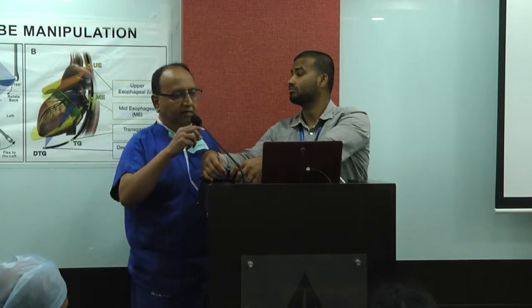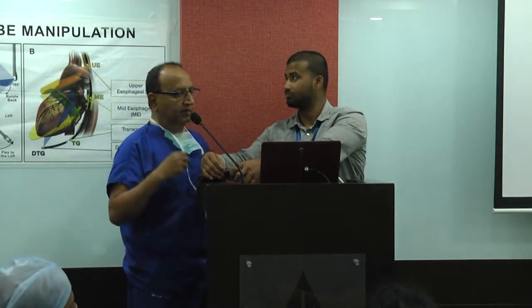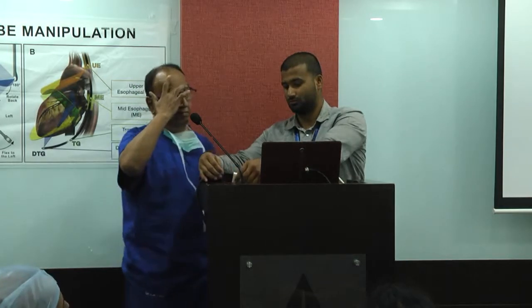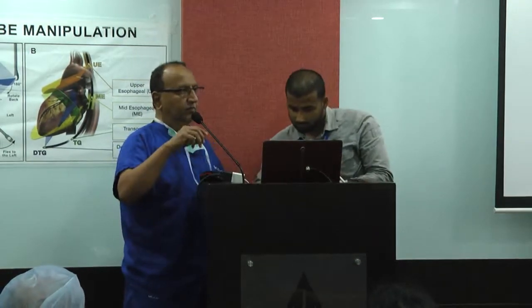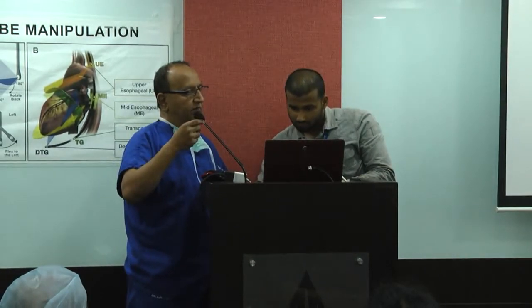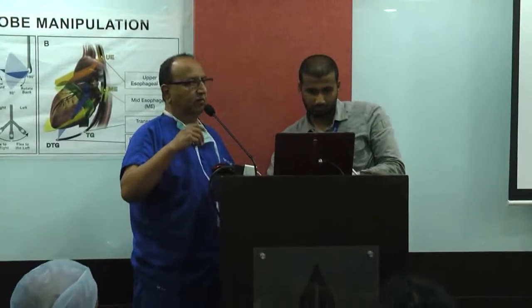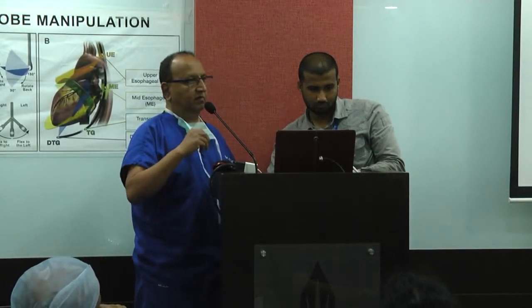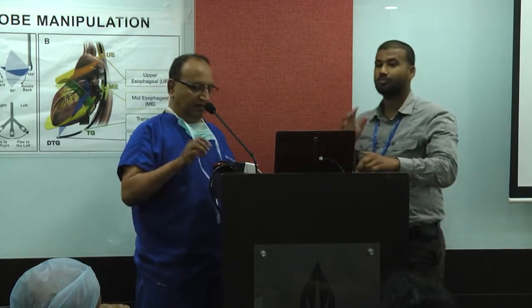I think the views and everything have already been covered by Dr. Raj there, so I'll be repeating a few of the same slides. Actually, to understand the aortic regurgitation process much better, I have interposed certain surgical views as well as case scenarios for us to understand how the valve looks during regurgitation, and what case scenarios we are going to have on aortic regurgitation.